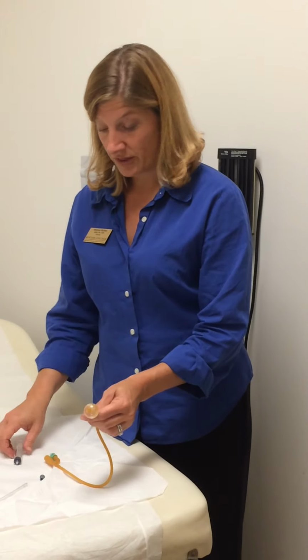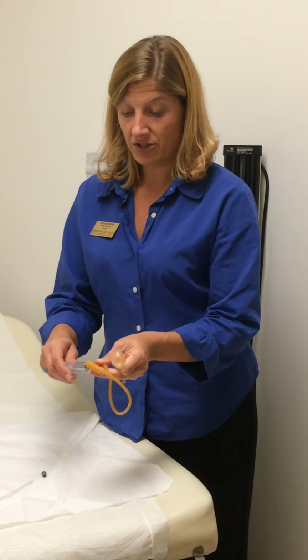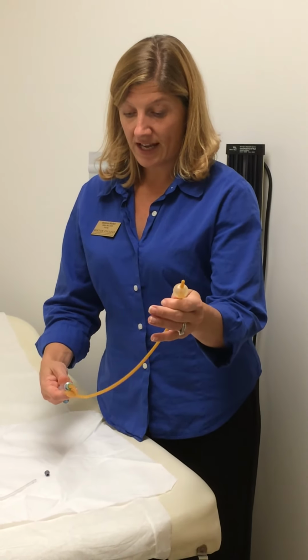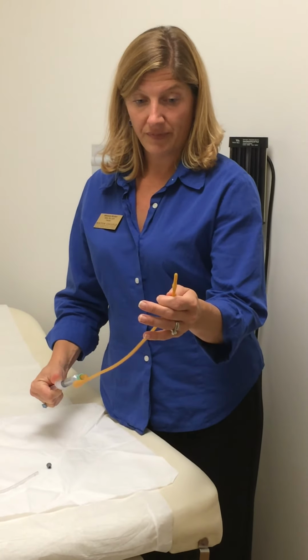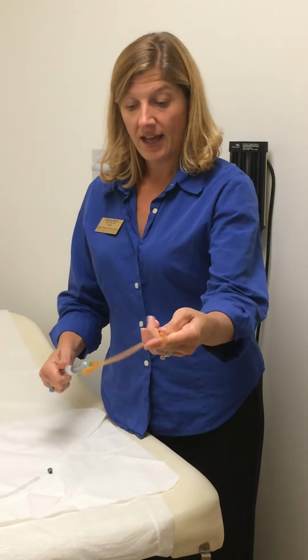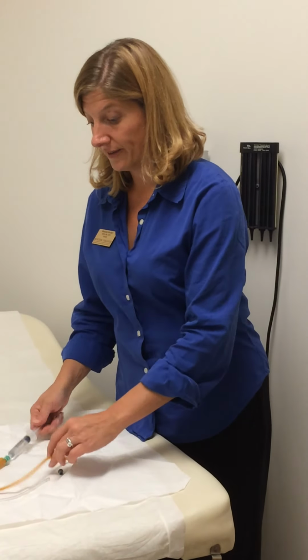When the patient is done with the tube and no longer needs this catheter, you would insert any syringe, making sure to take out all of the fluid in the balloon until it is completely deflated, and then the tube will gently slide out, and you will discard of it appropriately.